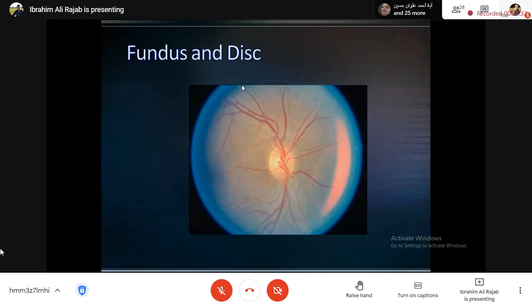أنفال مظهر. نعم دكتور. نعم أنفال. خلاص هم قالوا أكو well demarcated وقالوا أكو rim, then you should continue another. دكتور blood vessel. Yes. واضحة. أنفال تقدرين بس شوية تعلين صوتك؟ نعم دكتور. يلا البلاد فيسل ايش بيها؟ الفين هي larger وداركر صح.